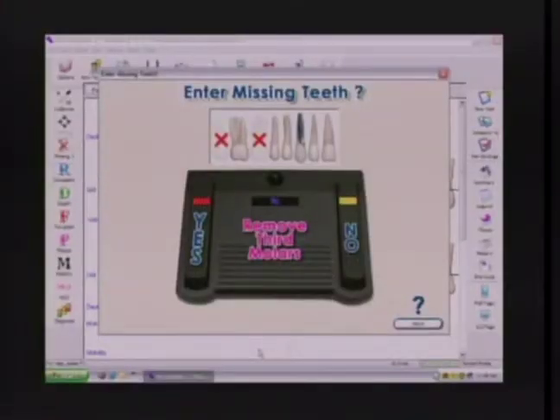The first time that I see this patient, I need to record the dentition, again, to stay on track. It really serves two purposes. It's going to skip missing teeth, pontics, and impacted teeth, but it's also going to highlight the relationship between implants, crowns, bridges, and periodontal disease. So the question is, do you want to record the missing teeth? And the answers are here with the foot pedal. No means this patient has 32 teeth and no other dentition. I don't generally use that very often.